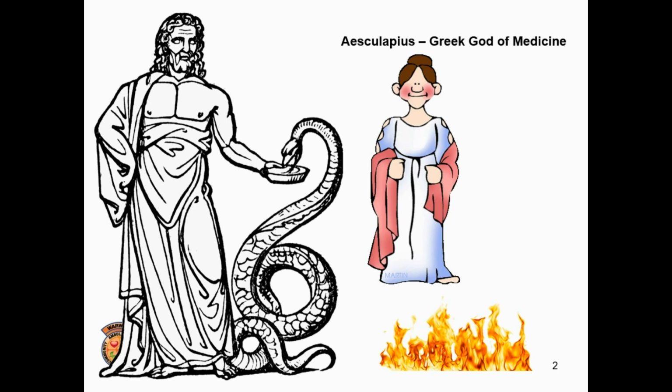The ancient Greeks believed that people had fires burning inside them that produced smoke. They called this smoke capnos, which is where we get the term capnography. They weren't entirely wrong. Today, we call fire metabolism, and the byproduct of metabolism is CO2, and that's our smoke.